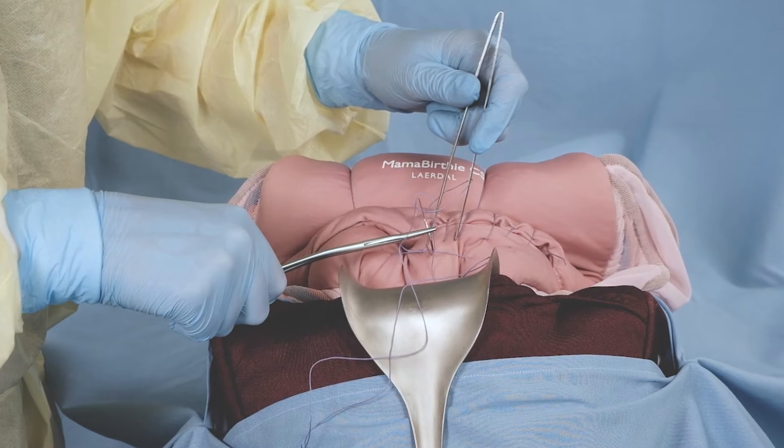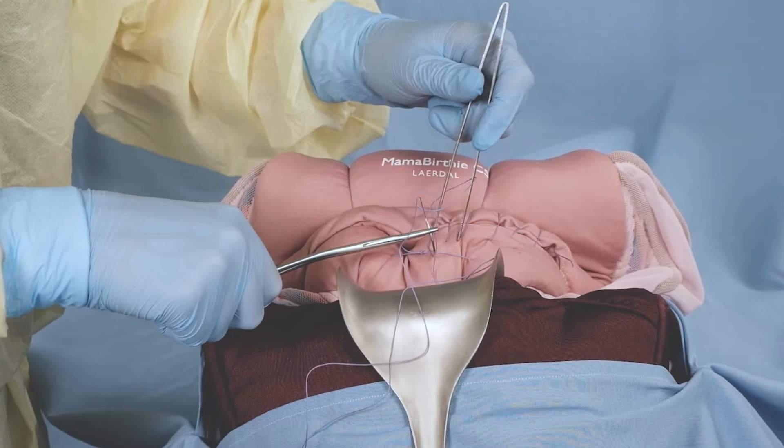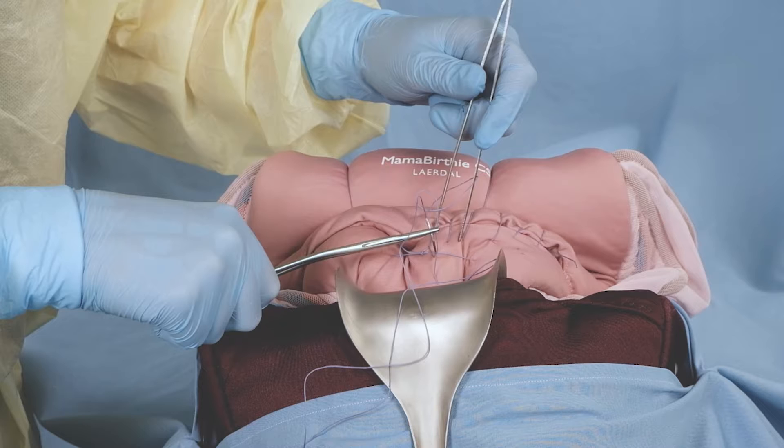This is an instructional video showing how to use Mama Berthy CS to perform a B-Lynch compression suture to manage severe postpartum hemorrhage.